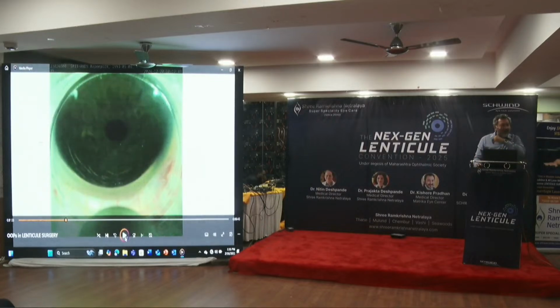If you're thinking it's too scary to do something, you just do a transepithelial PRK, or a PRK on top of it. Sometimes you might have to wait, but many times when I get a suction loss, I don't wait. I just wait for the bubbles to clear and I go do a trans-PRK immediately.